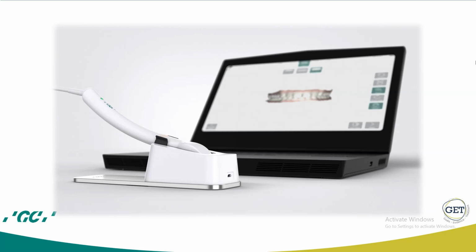The computer itself is a high-performance computer which has a graphic card on which the parallel graphic processor runs in real time. The operating system and the user program must not be modified by the user. Software updates are managed by GC Europe.